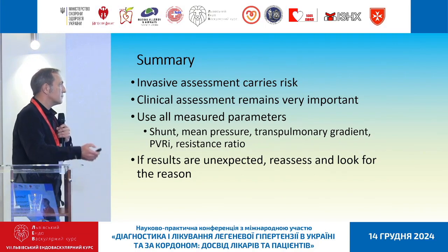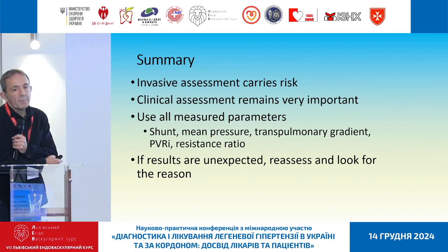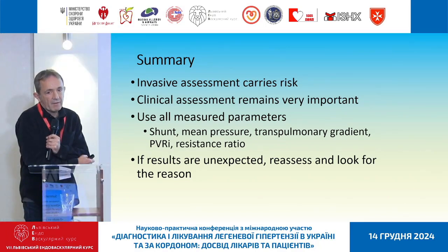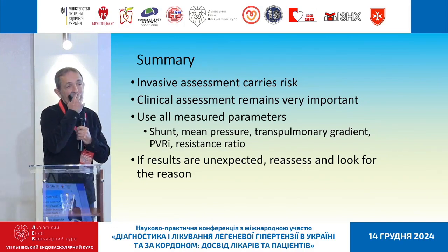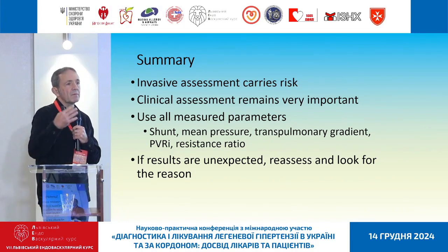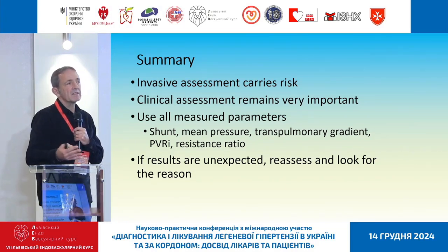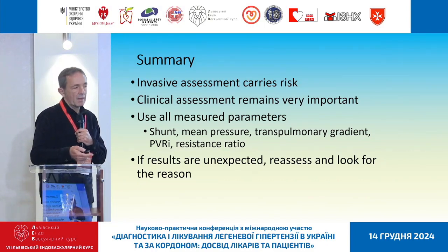So in summary, invasive assessment does carry risks, but it's often necessary. But it doesn't mean you shouldn't undertake very careful clinical assessment, which I think is still very important in these patients. You need to use all measured parameters and not rely on one. They all have different errors associated with them. And really, this is about getting an overall feel for the patient as much as getting one individual number. And if you find unexpected results, if there's something you don't understand, then repeat the set of measurements, reassess it, and try and find the reason. Thank you.